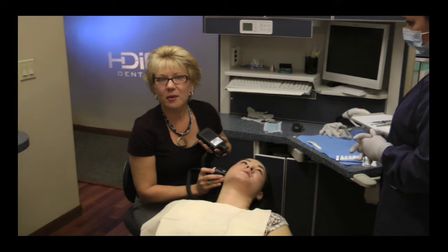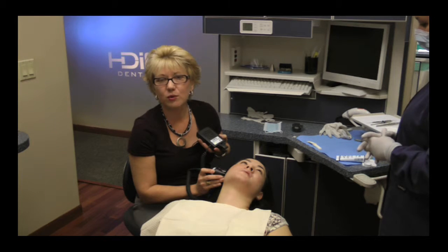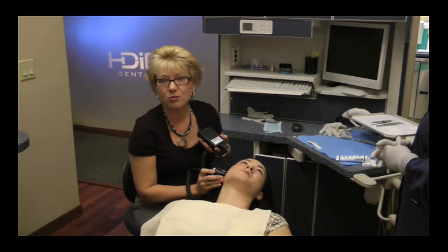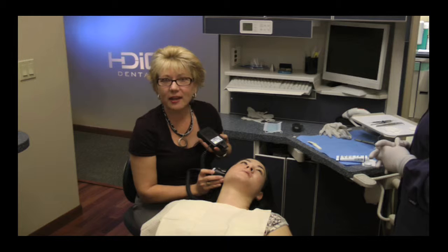Perfect. So now I'm going to turn the sound down for a second so we can talk. What you'll notice is I ask Katie to move quickly, because when she moves quickly, I hear a lot of crunching noises. That's actually turbulence in the synovial fluid because she's moving so quickly. When I actually do the Doppler exam, if she moves too fast, I will think I hear crepitus, but it's a false positive. So I'm going to have to control her movements now.